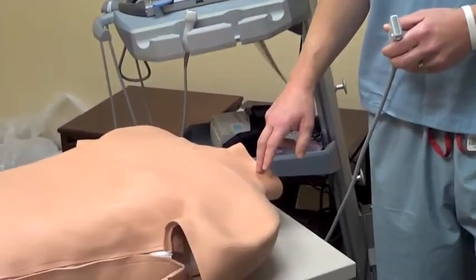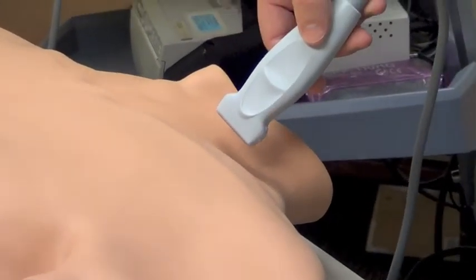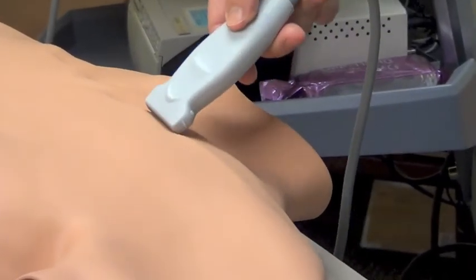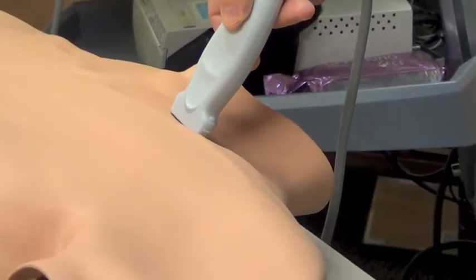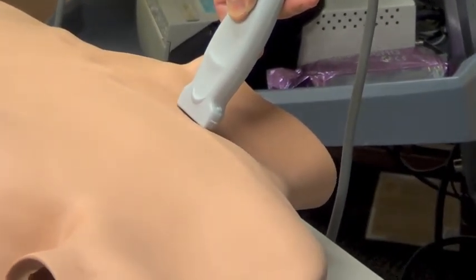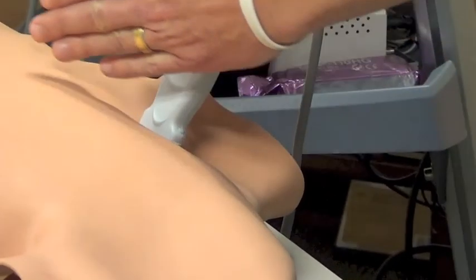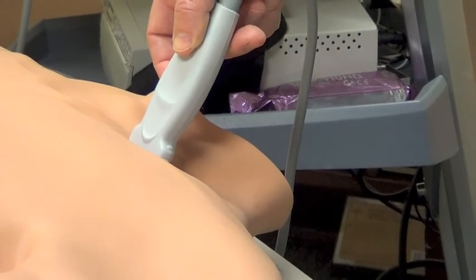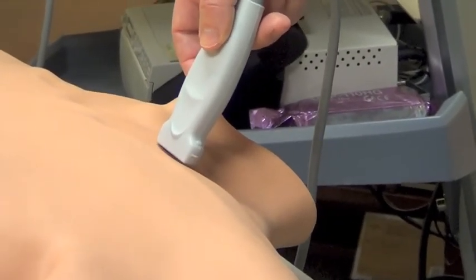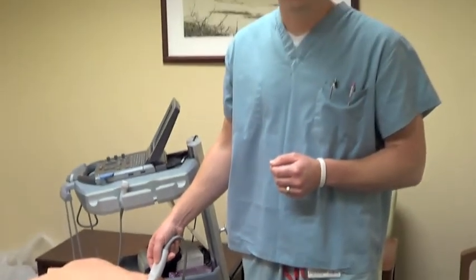One of the ways that we have discovered to combat this is, as the wire is being inserted, take the ultrasound probe and push it just superior to the clavicle right at the junction of the subclavian vein and the internal jugular vein, applying some pressure — therefore forcing the wire to stay on its trajectory towards the superior vena cava. In this fashion we can also, if we let off a little bit of pressure, visualize on the ultrasound screen whether or not the wire is in the internal jugular vein.